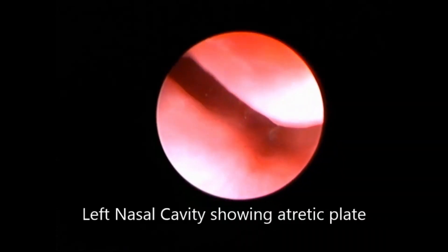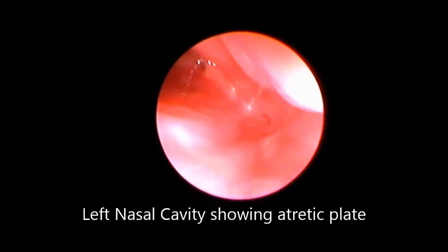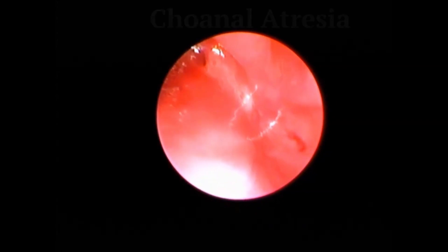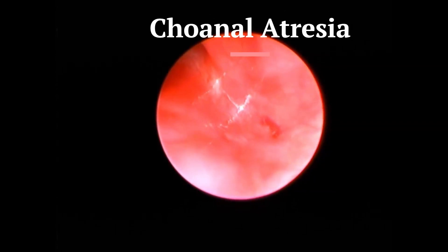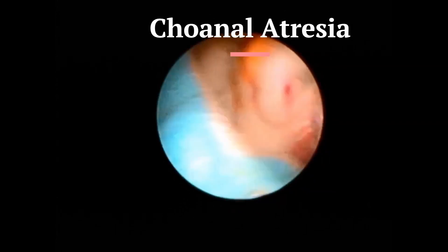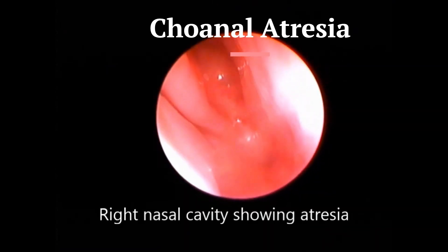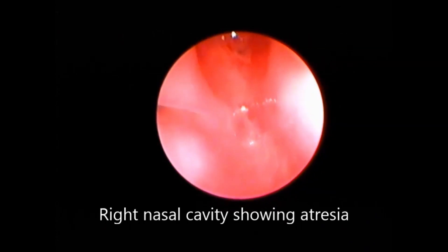A very young newborn, almost four days old, came with a complaint of difficulty in breathing. On nasal endoscopy, we used a small 2.7mm scope for examination, and we can see an atretic plate on both sides — on the first pass we are not able to see the nasopharynx.